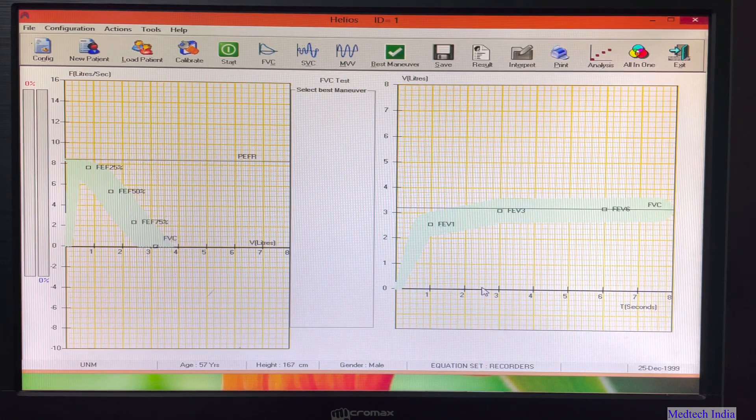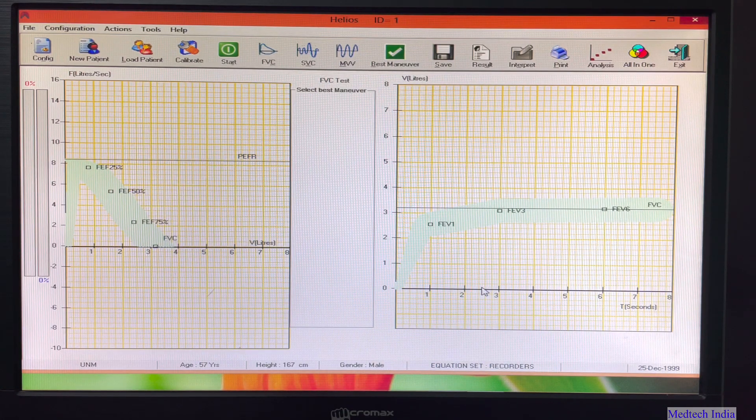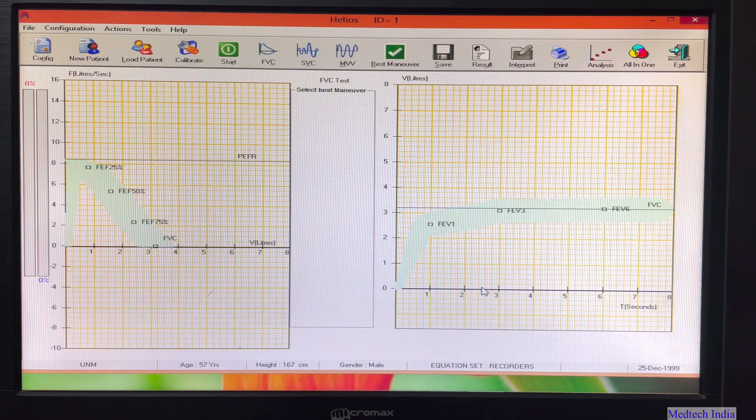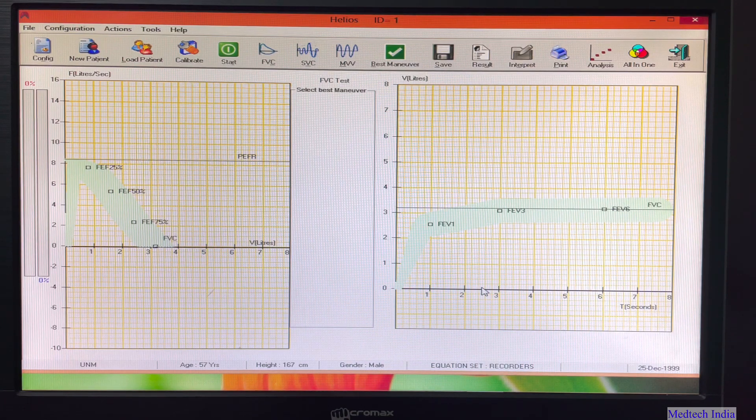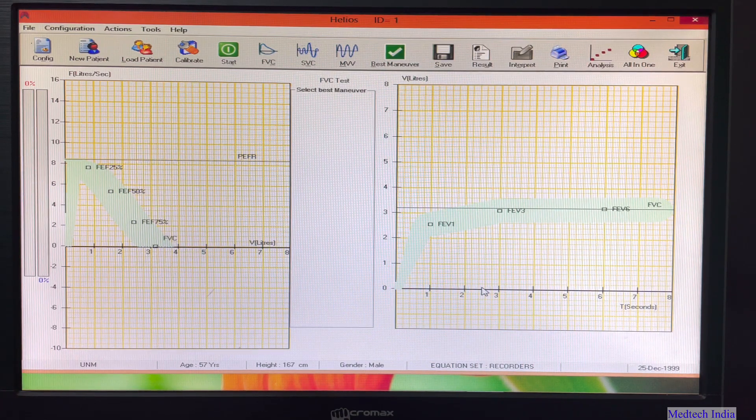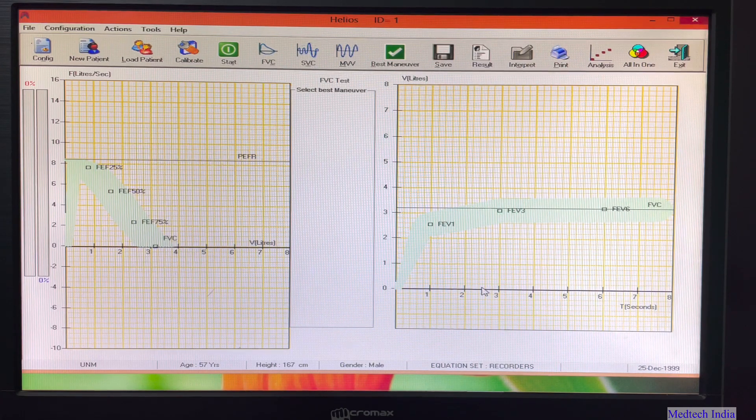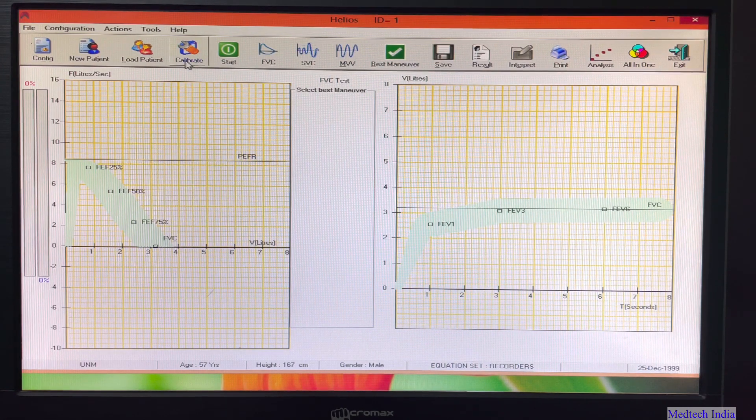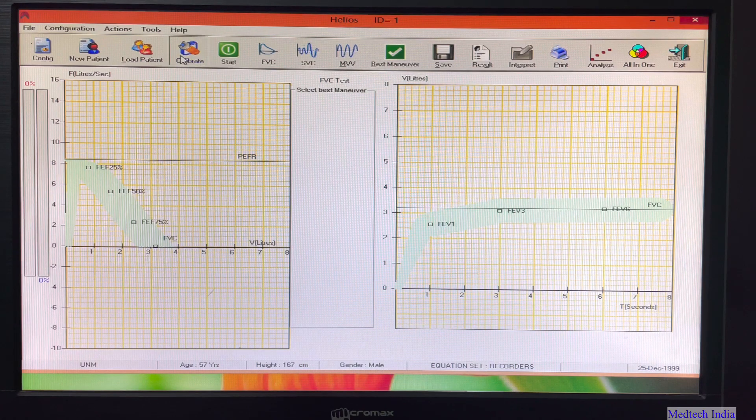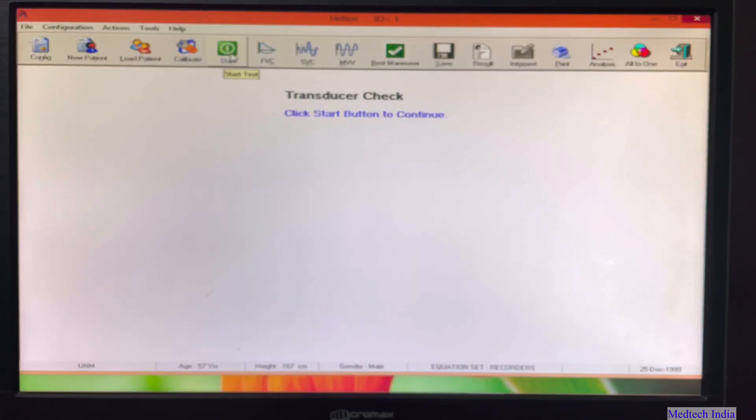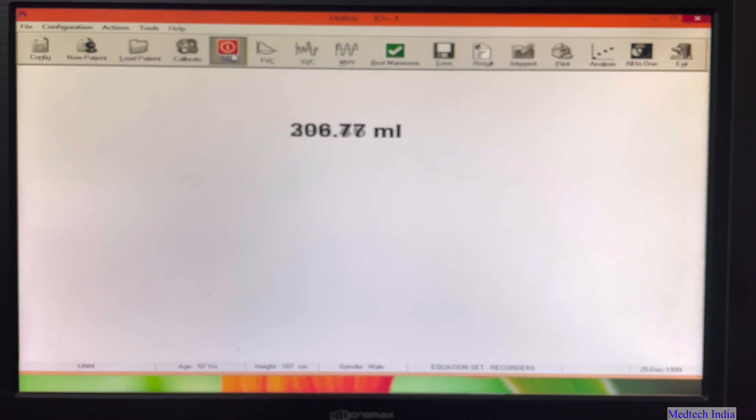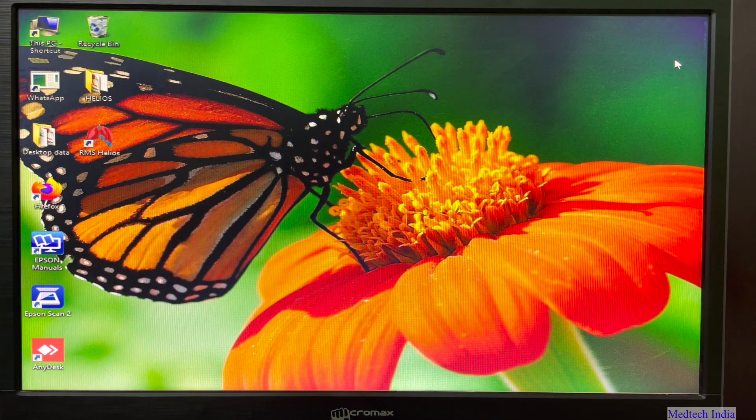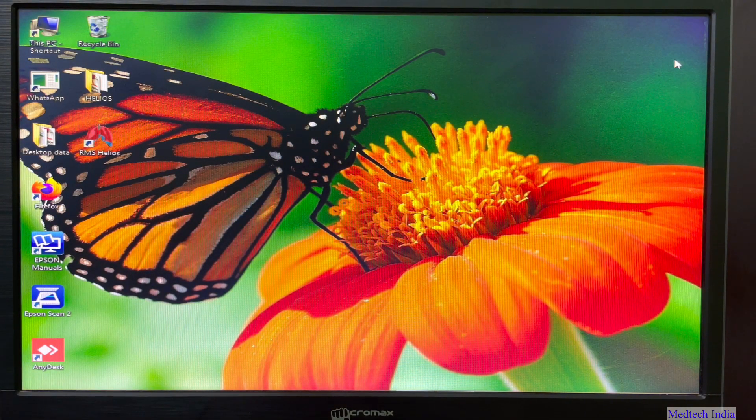Next onwards, whenever you will click on RMS Helios icon for opening the software, you will get this graph directly. No need to make any settings again. At last we will check whether our device is working or not. For that just click on calibrate, then start. Then just blow in spirometry device. So here you will get certain values. If these values are coming, means your device is working fine. Now we have completed unboxing device setup and software installation.